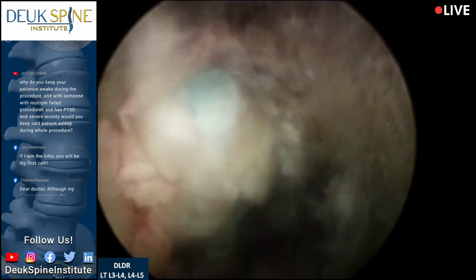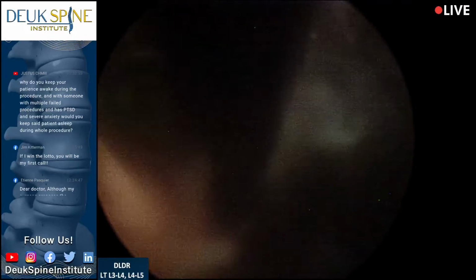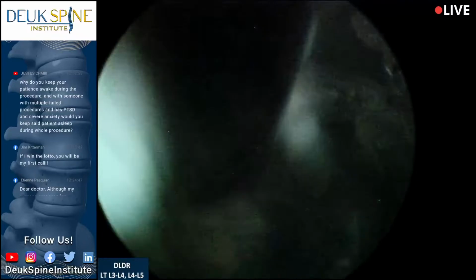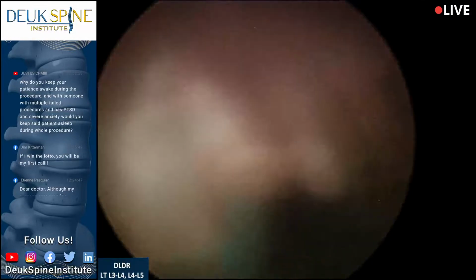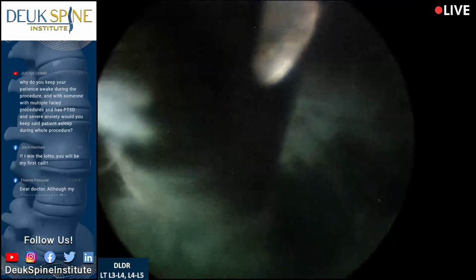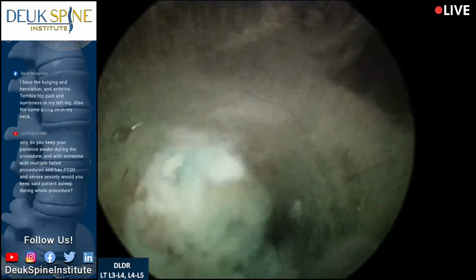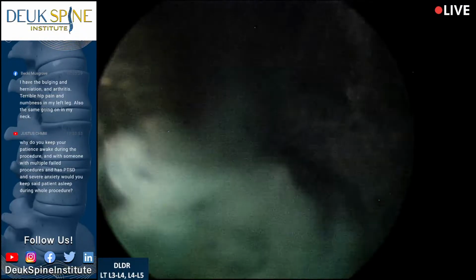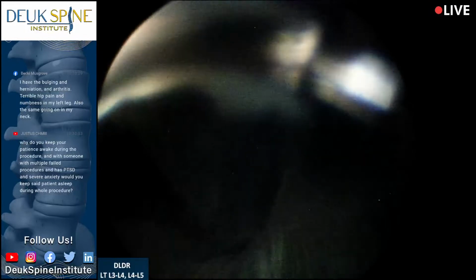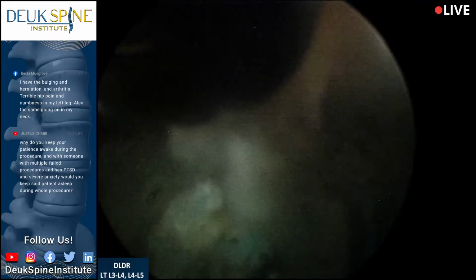That's the herniation stuck in the tear. There's a lot of inflammatory tissue around it, the pink stuff. This is where the pain's coming from. So I'm going to try to pull out any pieces of herniation I can. Because remember, I just went in through the herniation, so we really shoved the pieces of herniation back into her disc. By the way, that's a much safer way to remove herniated pieces of disc, is inside the disc rather than outside. Outside the disc, you're talking about possibly injuring the nerve if you're grabbing with these metal grabbers in the foramen. So it's better to always remove herniations from inside the disc rather than outside.